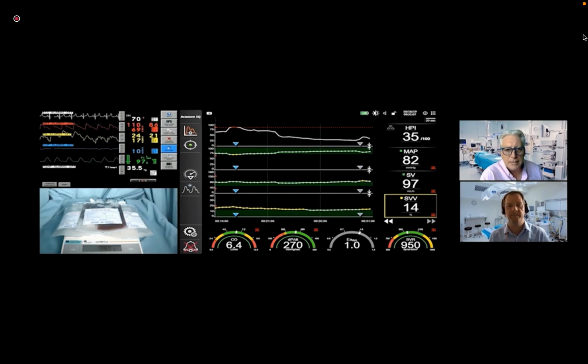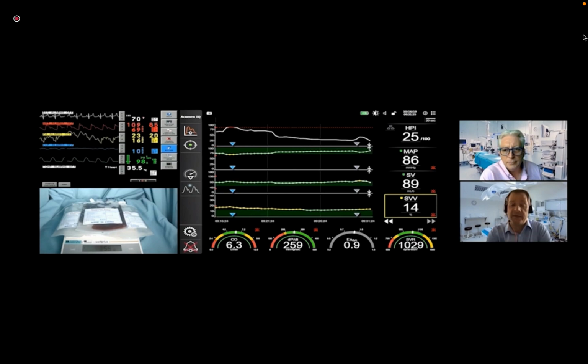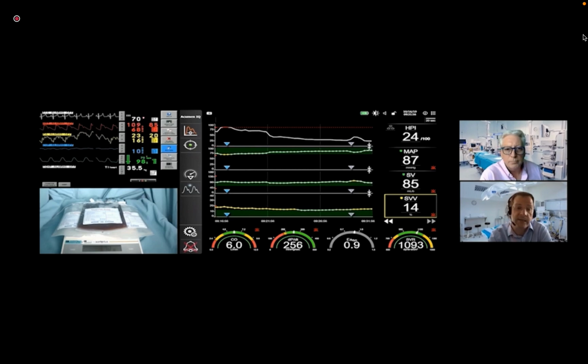I'm assuming that was just a coincidence because there had been almost no hemorrhage at all. Hard to say, Monty, but you frequently see, once you start taking even just a small amount of volume from the models, that subtle physiological change is detected by the algorithm. Then as you compensate for that, because it's relatively small amounts of hemorrhage, we see it come back down to our baseline value again.